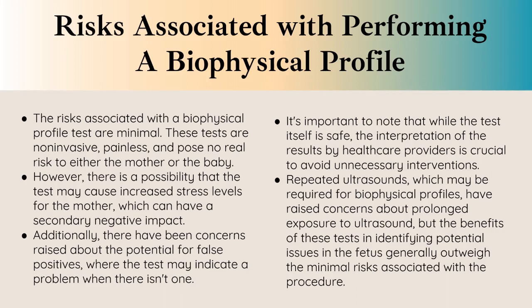The risks associated with a biophysical profile test are minimal. These tests are non-invasive, painless, and pose no real risk to either the mother or the baby. However, there is a possibility that the test may cause increased stress levels for the mother, which can have a secondary negative impact. Additionally, there have been concerns raised about the potential for false positives, where the test may indicate a problem when there isn't one. It's important to note that while the test itself is safe, the interpretation of the results by healthcare providers is crucial to avoid unnecessary interventions.